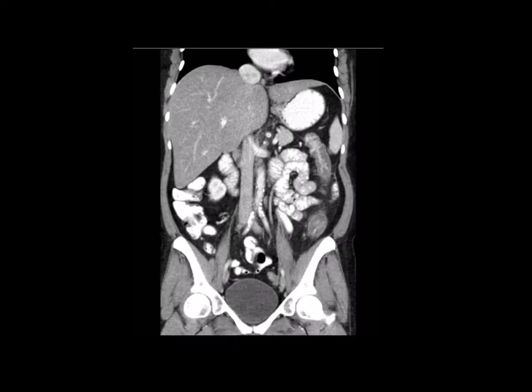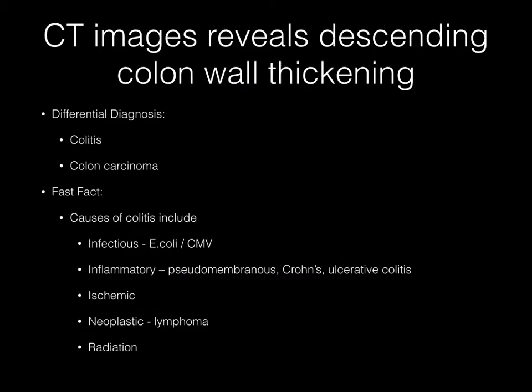Now pause your media player. Coronal CT image of the abdomen demonstrates descending colonic wall thickening. The differential diagnosis here includes colitis, which I would favor in this case due to the long segment that is involved, as well as colon carcinoma.